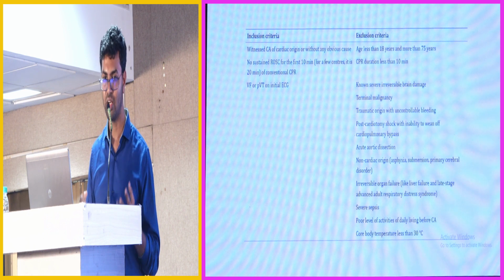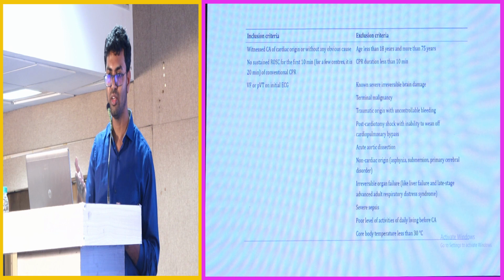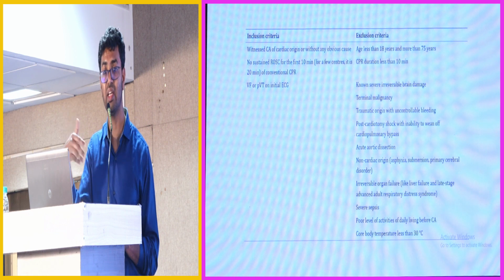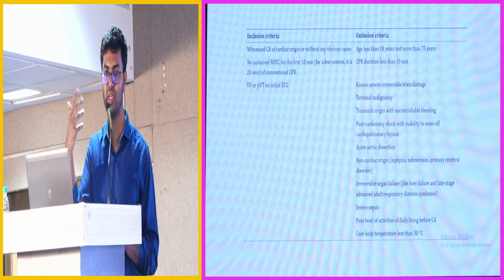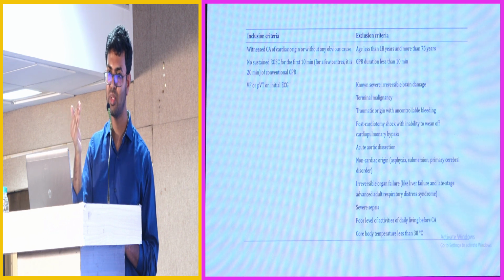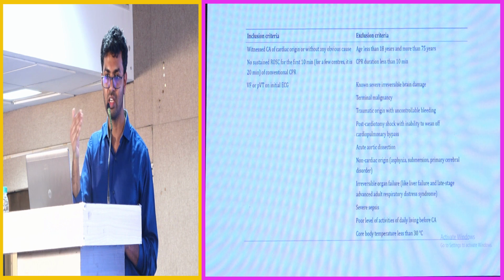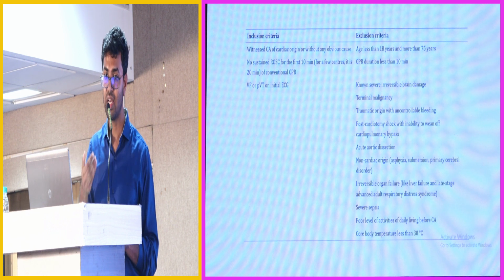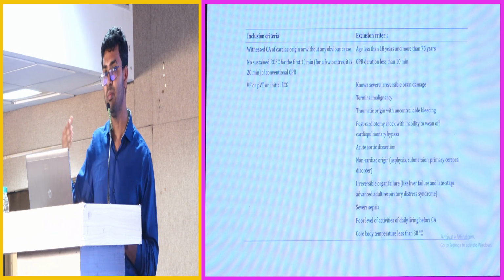We maintained her on ECMO, and the thing with ECMO is that you can maintain the temperature of the blood and the temperature of the patient itself. So we cooled her to 34.5 to 35 degrees for 2 days. Then she woke up. After that, her right ventricle started improving. Then we placed an Impella device.